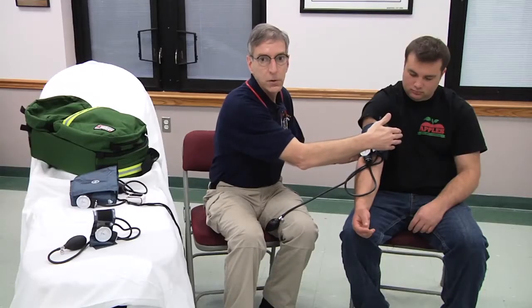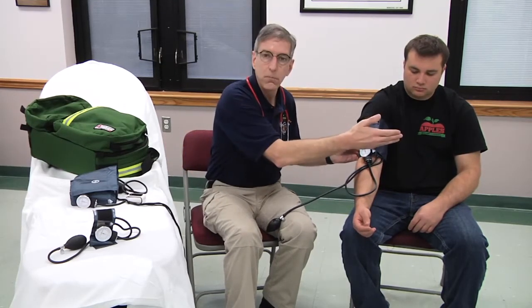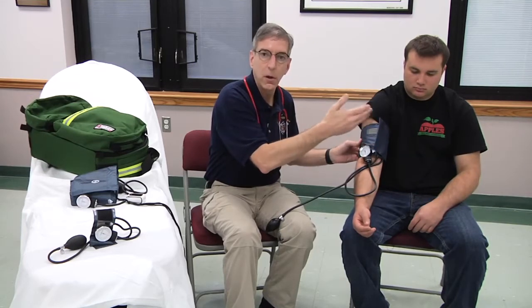So if you have an individual who's laying on the street on their side, or laying on the stretcher on their side, and you're measuring a blood pressure, that extremity could be above or below heart level. You'll get a false blood pressure based on that.